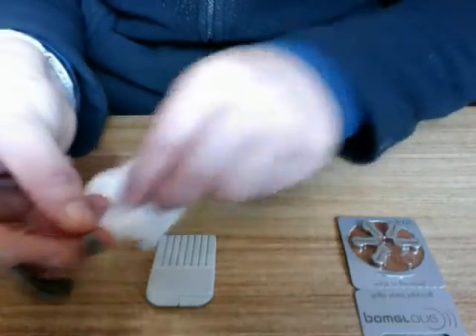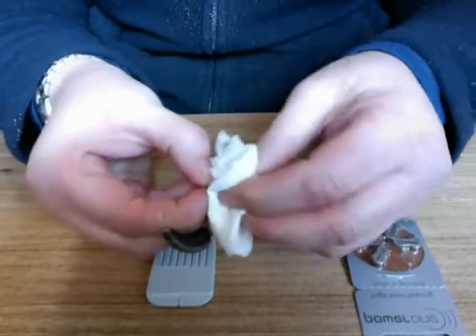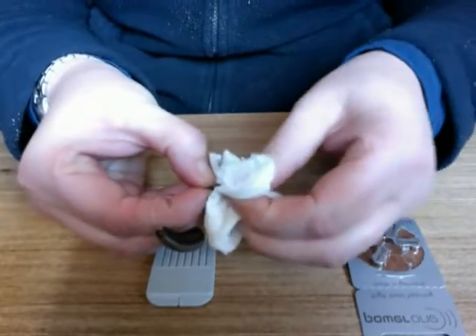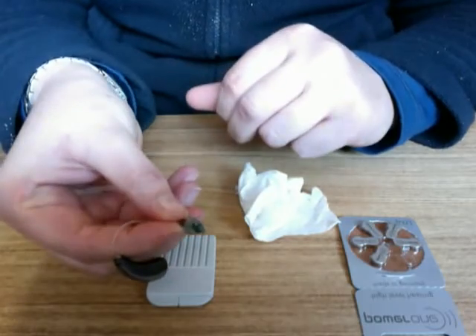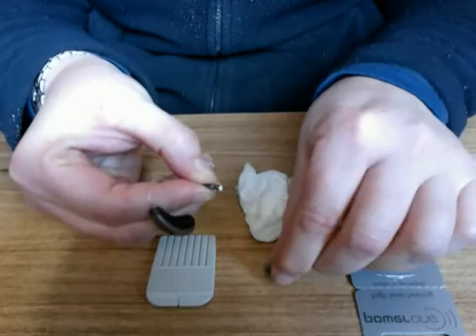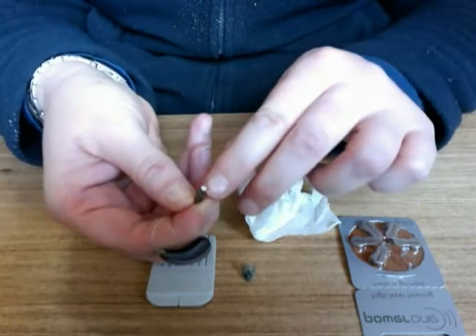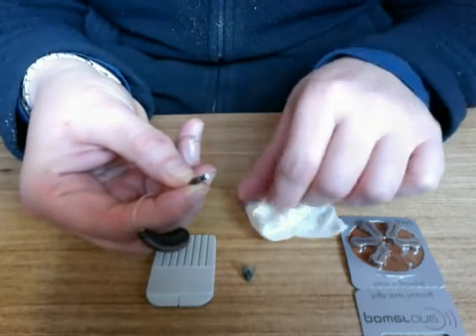The first thing is to wipe the dome with a tissue — that will remove any excess debris. If this does not clear the problem, we can remove the tip by giving it a firm tug and looking at the white wax filter that sits in the receiver.